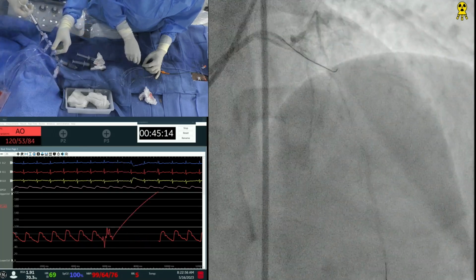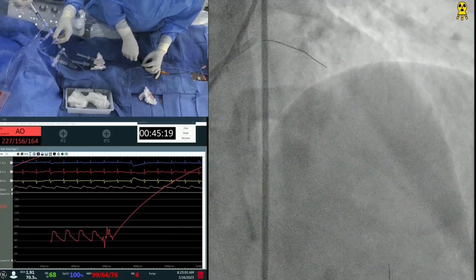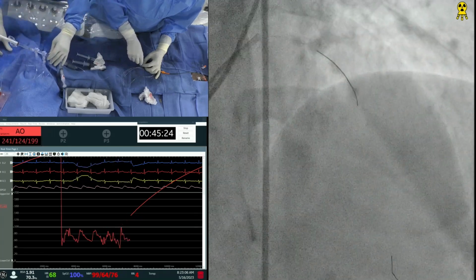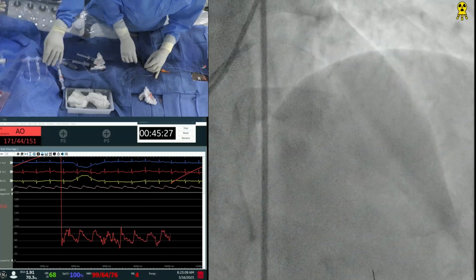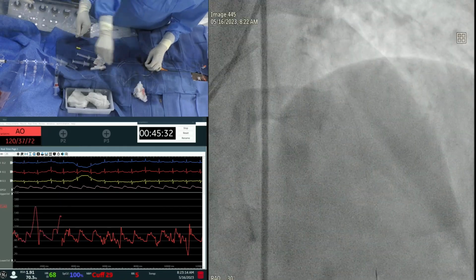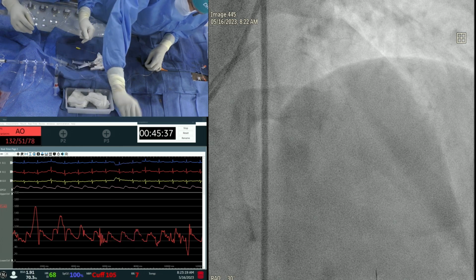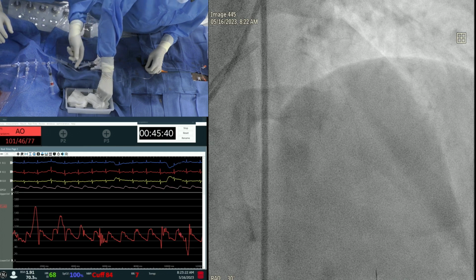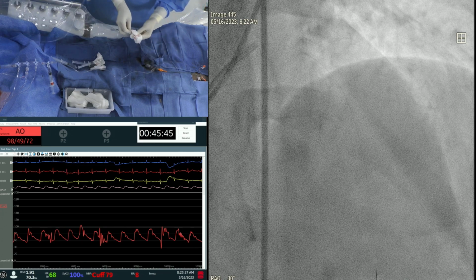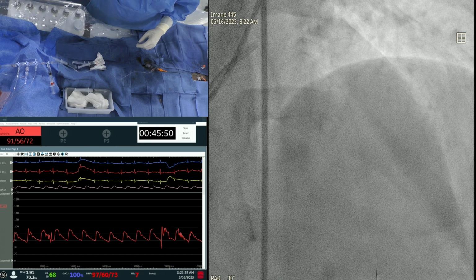I mean, two more questions have come. One is regarding the speed of the rotablator and what anticoagulant are you using? Yeah, so speed, basically, we have always talked about that now we are going to the low speed, which is 140 to 150, around 150,000 RPM. Although there's only one randomized trial to look into two speeds, and there was no difference in MI and slow flow in a 100 patient trial from Japan. But at the same time, what we saw in our practice is that by using a slower speed, ablation efficiency does go down a little bit, but it caused less slow flow and less perforation.